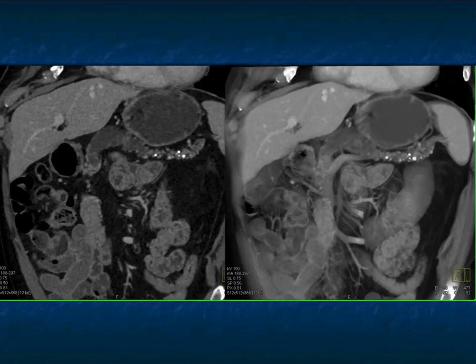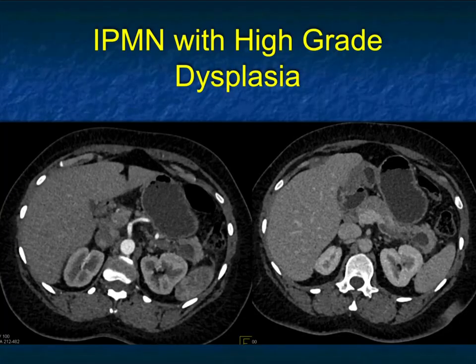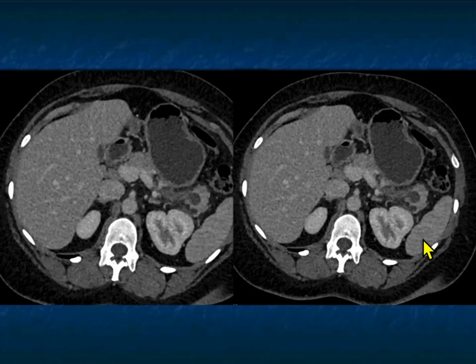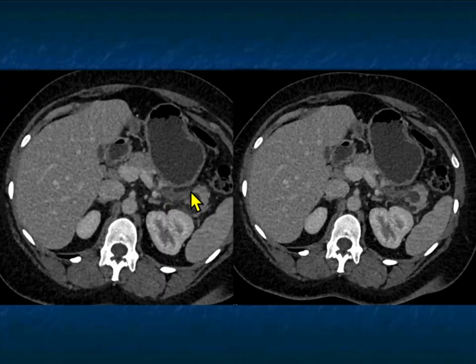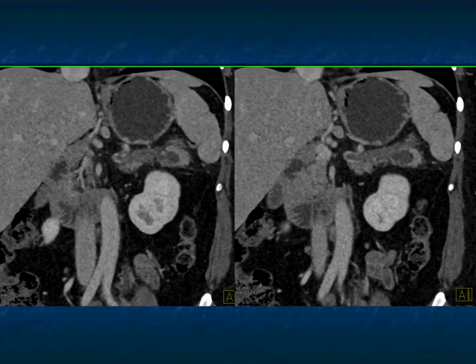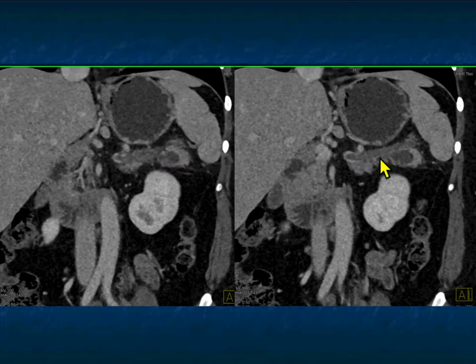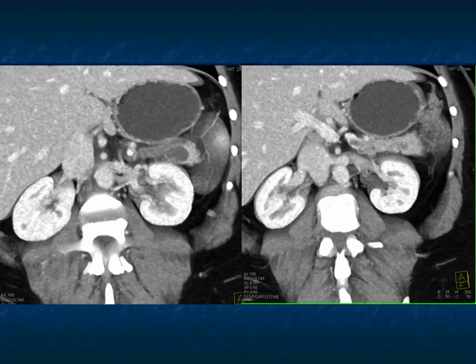One takeaway is that we can at times suggest low-grade dysplasia, intermediate or high grade — though it's not always easy. This lesion in the tail is a high-grade dysplasia. It's cystic, but when you look at it, you see the relationship to the pancreatic duct. Why not low-grade? When you look more carefully, there are textural changes in portions of the gland, the duct is dilated, there's some atrophy. The cystic component combined with these features makes me highly concerned for high-grade dysplasia or early malignancy. On coronal view, the cystic lesion is there, but look how irregular the pancreatic duct is — this is malignant till proven otherwise.